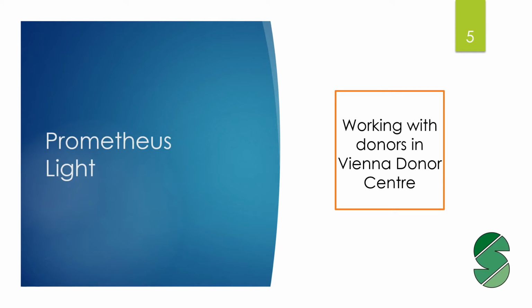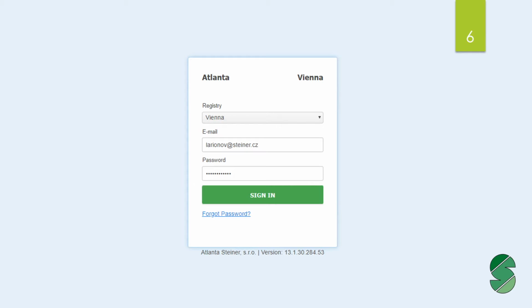Now, let me describe the process of managing donor records inside Prometheus Light. After opening the URL address of the Prometheus Light in your browser, you will see the following form. You will need to fill in the login credentials in order to proceed to the system.